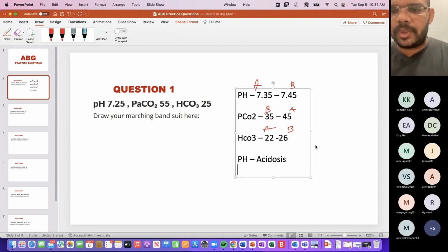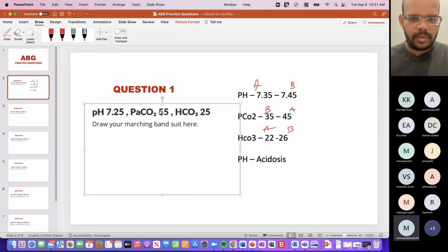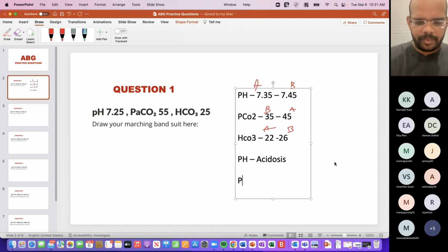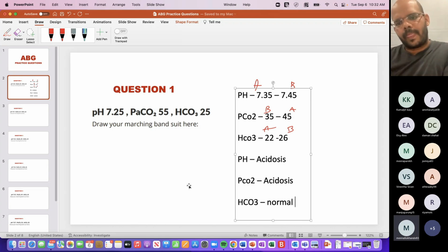Now next one, PCO2 is 55. So PCO2 is acidosis. Now bicarb. HCO3 is normal. Now what is your answer? It's respiratory acidosis.